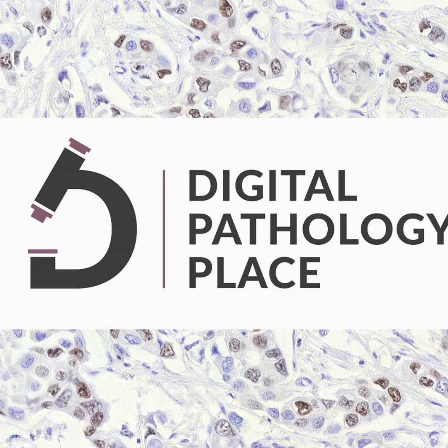Tissue samples themselves can be divided into different compartments based on their characteristics. A tumor region, for instance, can be further broken down into tumor stroma and tumor epithelial regions. In pathology, the basic unit of analysis is often the cell. However, interest may also extend to non-cell objects like Alzheimer plaques or to cell assemblies treated as a single unit, like the kidney glomerulus. By discerning and analyzing these distinct tissue compartments and objects of interest, pathologists can extract information out of images in a structured and logical way.